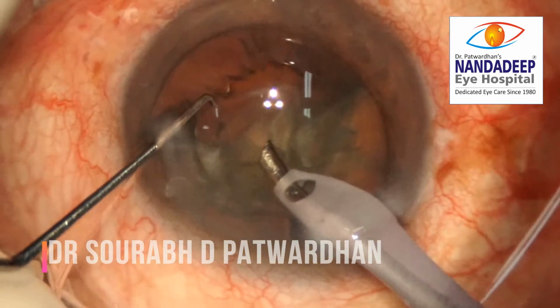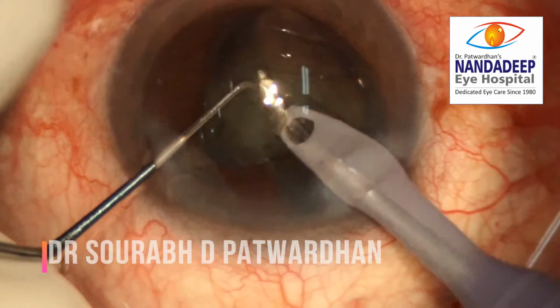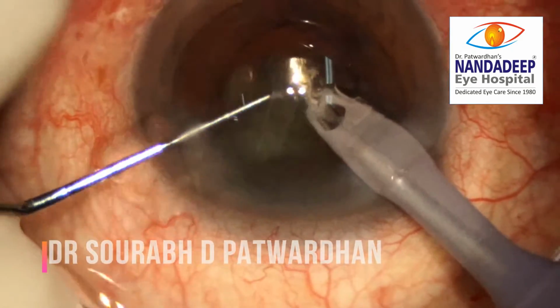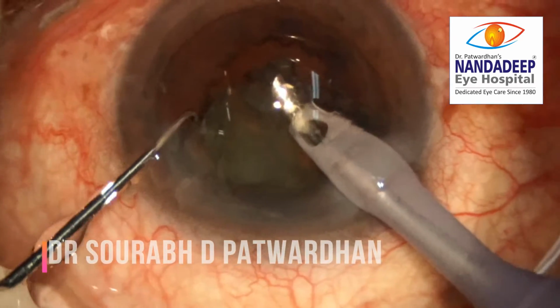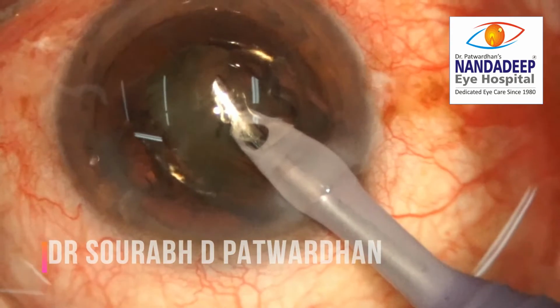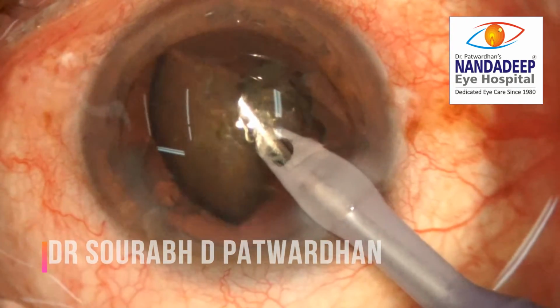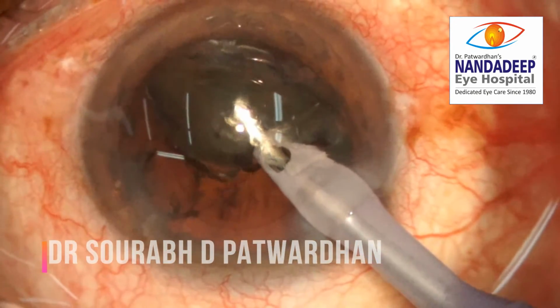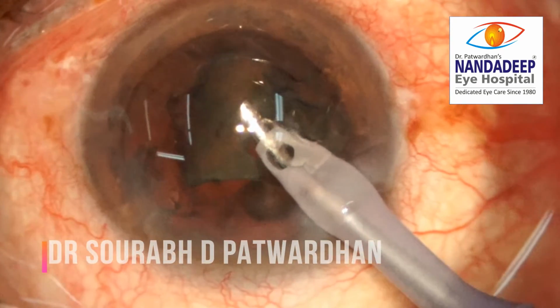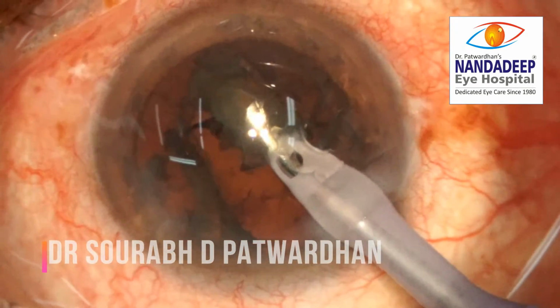If you see your own videos, sometimes you will find this kind of wound leak you are not actually observing, but it is there and causing a lot of fluctuation in the antechamber and the surge. So for the last piece, I decided that I will just take out my Sinskey hook. So the wound kind of closes, though there is a little leak which is going on, but the amount of leak has reduced. And you can see that immediately the chamber has become much more stable and there is no fluctuation of the posterior capsule.